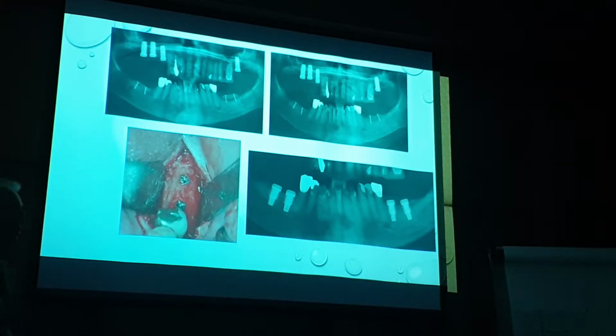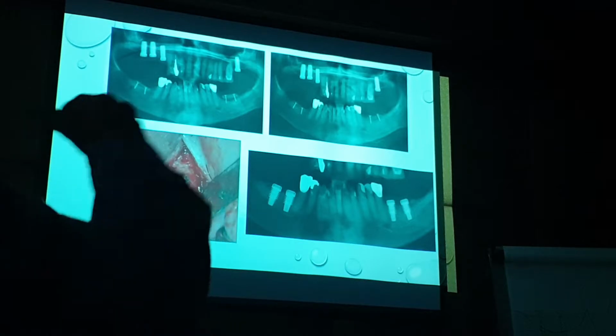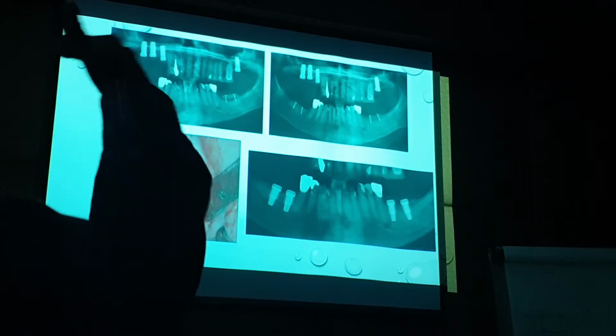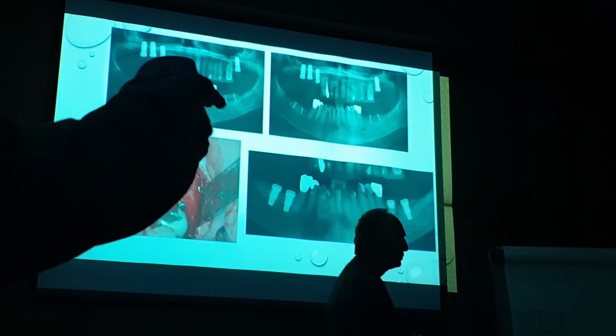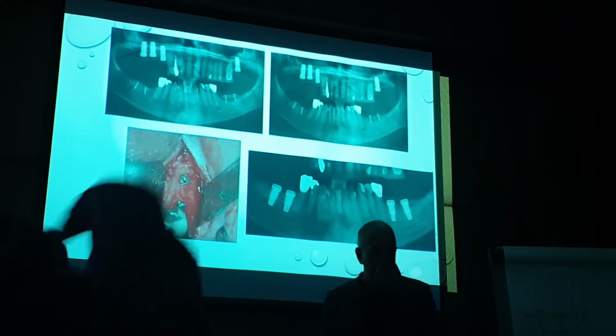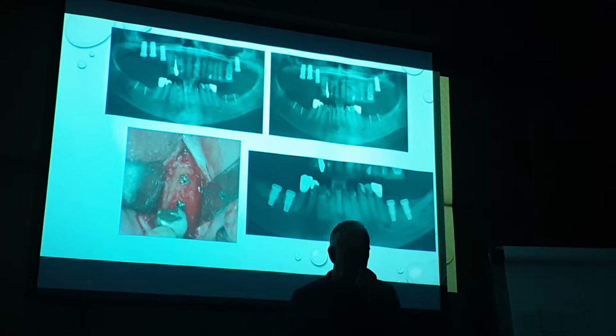I've done these with tenting screws, even vertical with tenting screws. Done every kind of thing you can imagine. It's all dependent on the site. That's why you need to have. To get a good height, just the cortical, even if there was a good crater there, to get a good height, just the cortical bone won't be enough, right? I mean, how can you get?